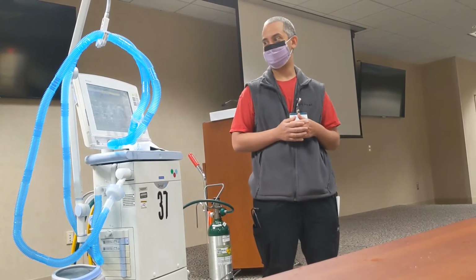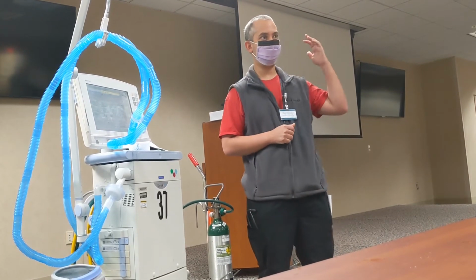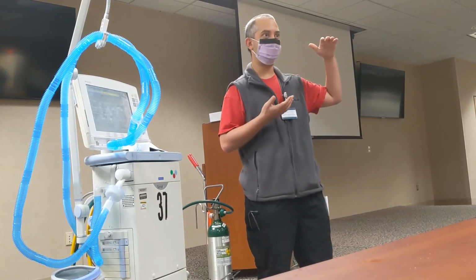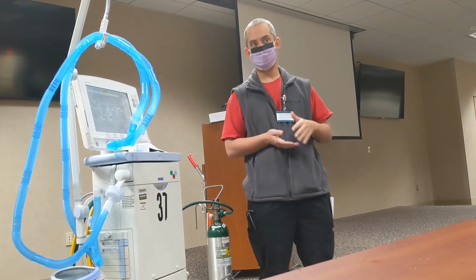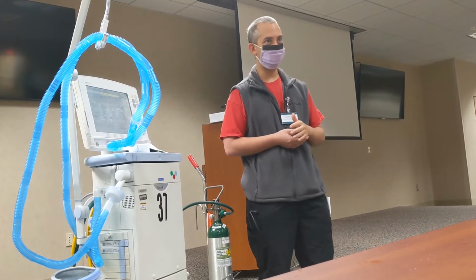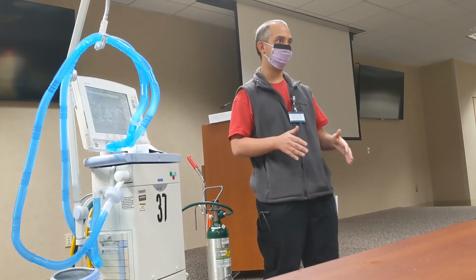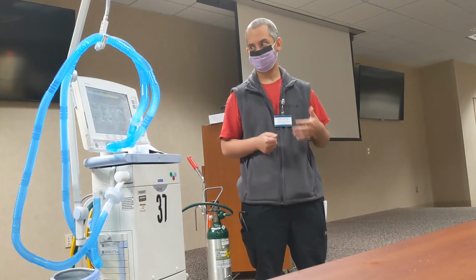And then after that, you're setting your P high, which is the pressure at the deep breath in. You're setting a P low, and that one's easy to set. That's always going to be 0. There's no reason for it to not be 0. You want them to ventilate and exhale all the way.